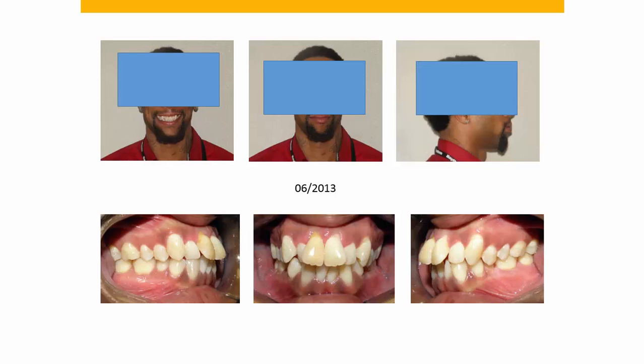With cone beam CT, we can see not only the tooth on an individual basis and its supporting bone, but we can see the anatomy of the underlying bone, which may not be consistent with the torque expression that we're using in our particular bracket prescription.